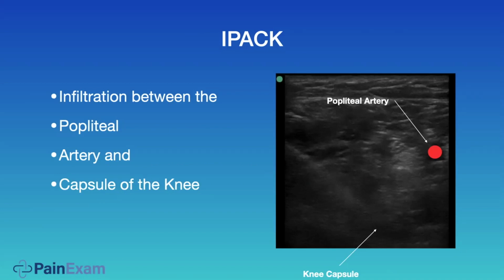In those cases, I've seen with patients who come back after a knee replacement, the knee is swollen, and the swelling from the actual surgery at the knee impedes the venous flow or lymphatic drainage of the lower extremity, and that gets swollen. So I've been able to reduce inflammation and that lower extremity swelling by doing a steroid injection near the genicular nerves.